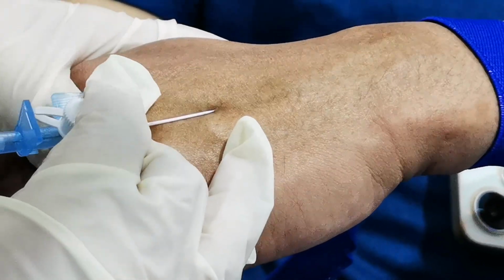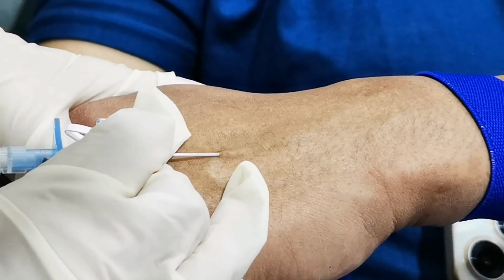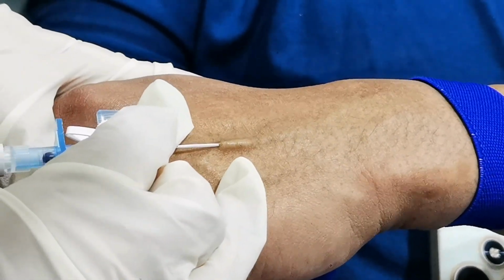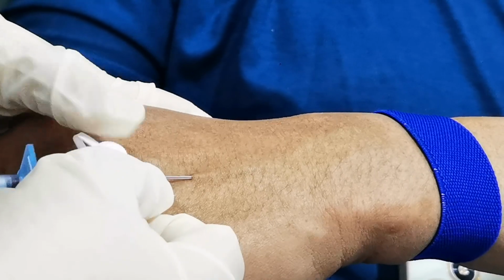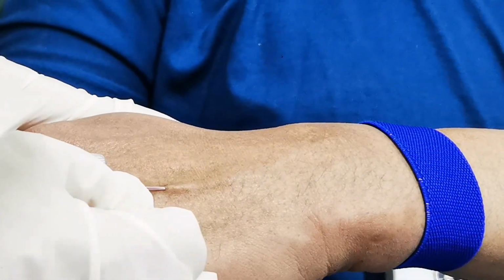At a 10 to 30-degree angle, puncture the skin. Advance the needle into the vein. Once the blood is visible in the flashback chamber, continue to advance the catheter about 0.25 inches into the vein. Slightly pull the needle to make sure there's backflow, and then advance the catheter.